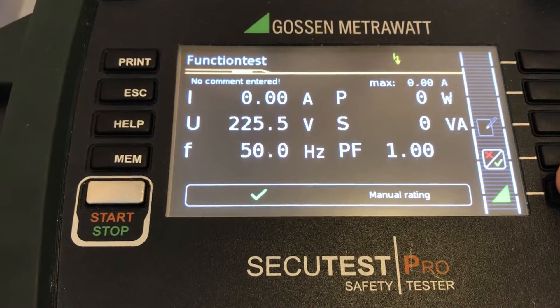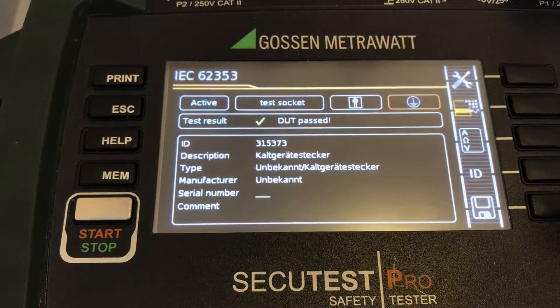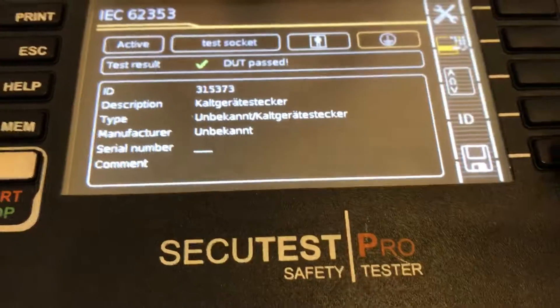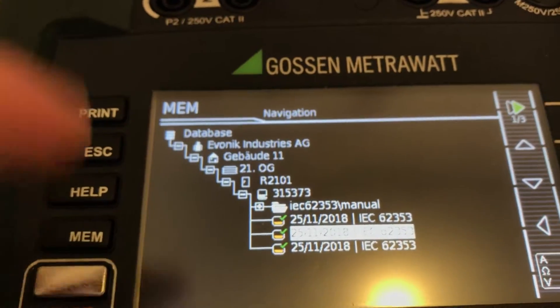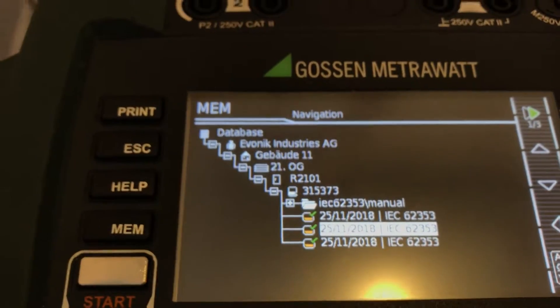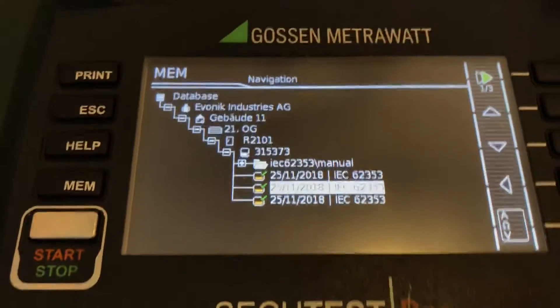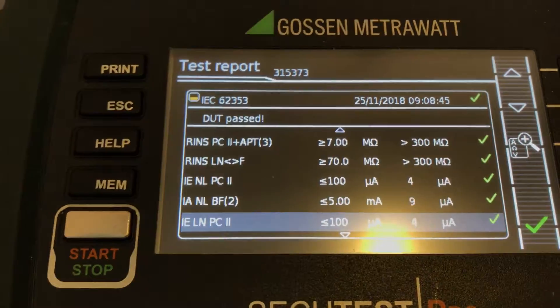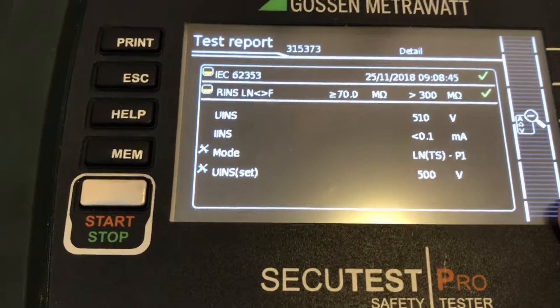Now at the end we're going to run a functional test. It then gives us an overview, and afterwards we can store the results in our database. The results have been stored and we can browse the memory to see our performed tests. We can also view the data here to show both the initial data and the detailed data.